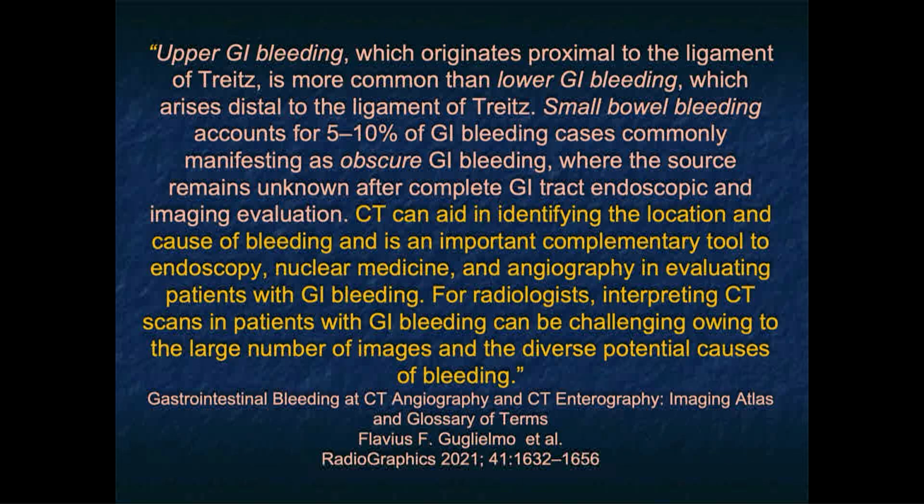It's interesting, upper GI bleeding evaluation with CT was really more important as COVID took over. Remember, in the COVID era, lots of patients had GI bleeding, both upper and lower GI bleeding, in addition to all sorts of retroperitoneal bleeds. But the endoscopist did not want to do endoscopy. And so CT became a very, very good study. And it's continued to be that because we had very good results. And I think endoscopists also appreciated the role of CT.